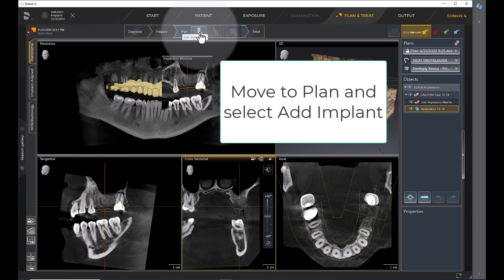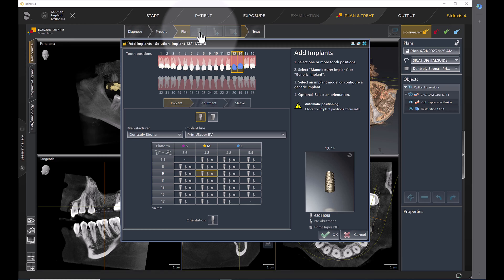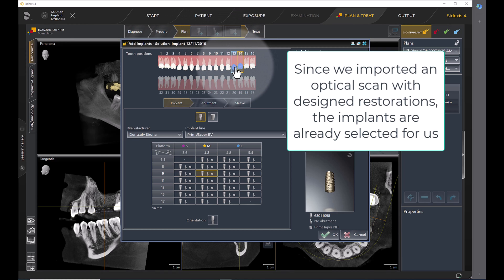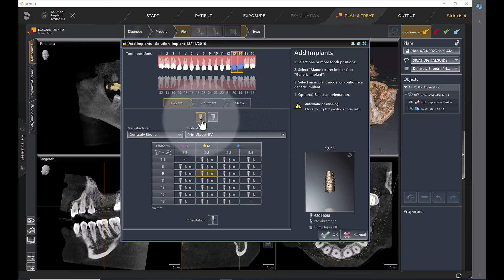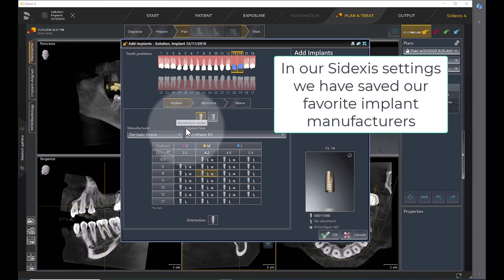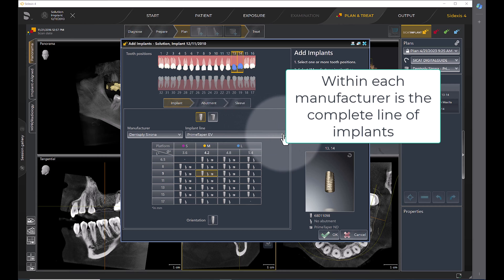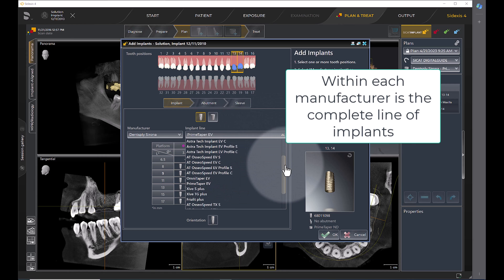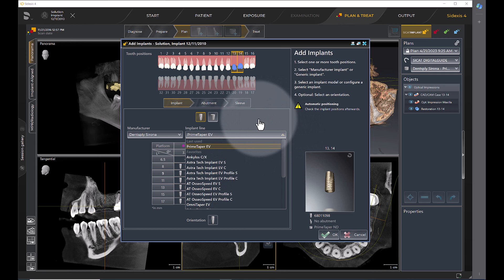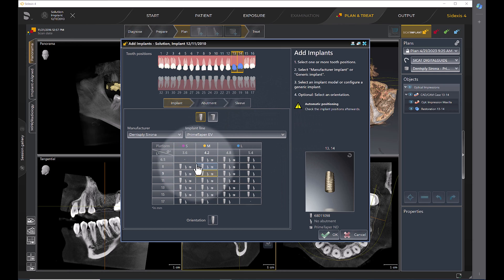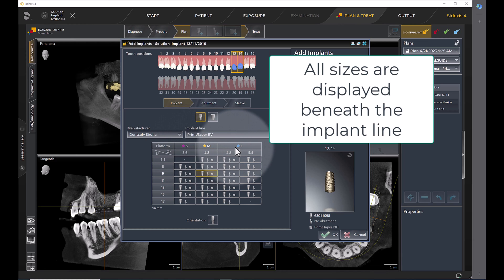Move to plan and select Add Implant. Since we imported an optical scan with design restorations, the implants are already selected for us. In our Sodexa settings we have saved our favorite implant manufacturers. Within each manufacturer is the complete line of implants. All sizes are displayed beneath the implant line.